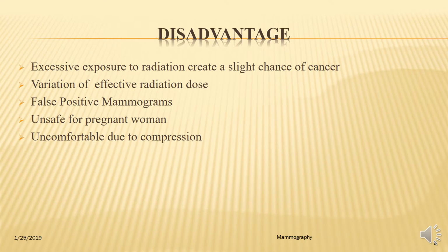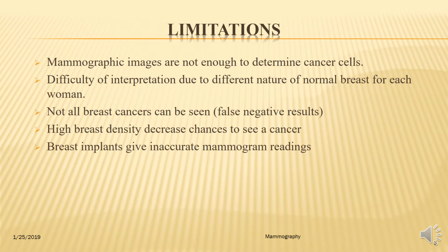A woman should always inform their physician or X-ray technologist if there is any possibility that they are pregnant. These are the disadvantages of the mammography device.